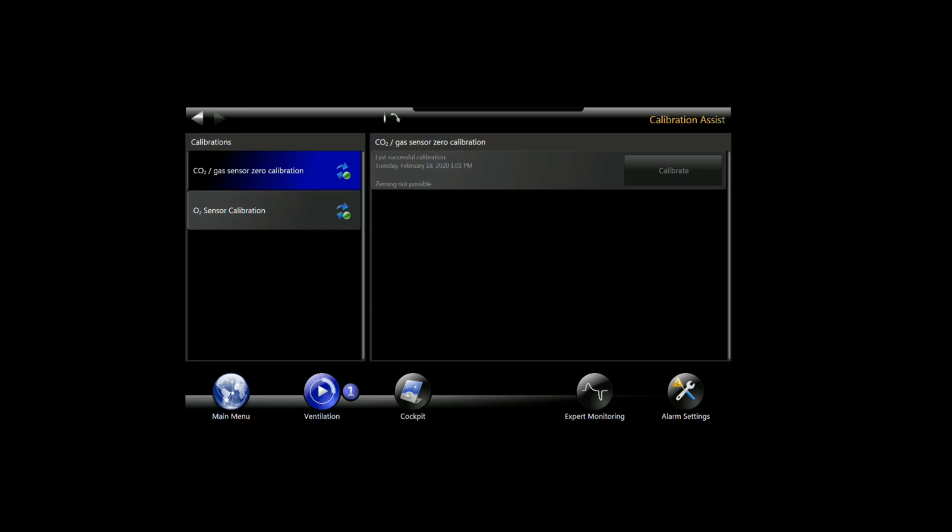You'll hear the tone. The ventilator recognized that it was attached and you can see that my last calibration was earlier today.